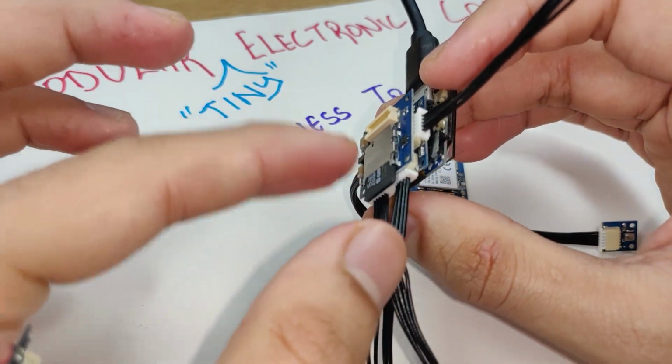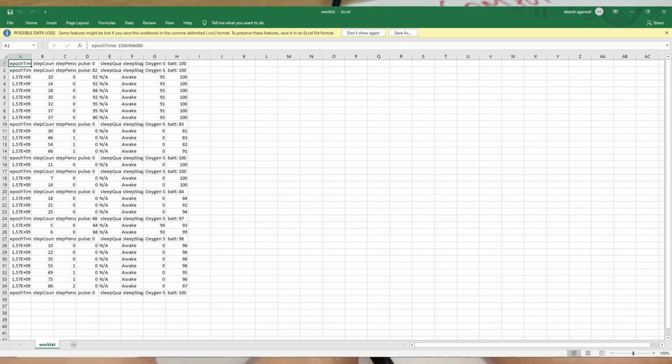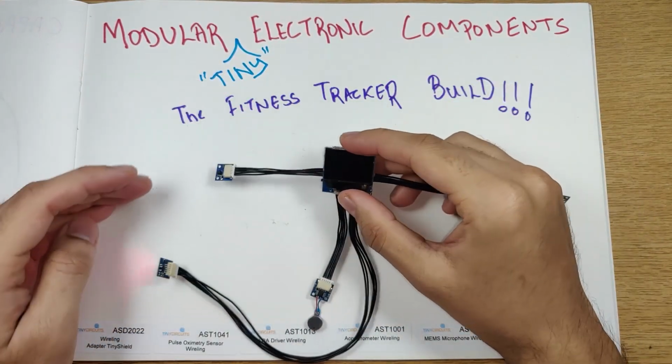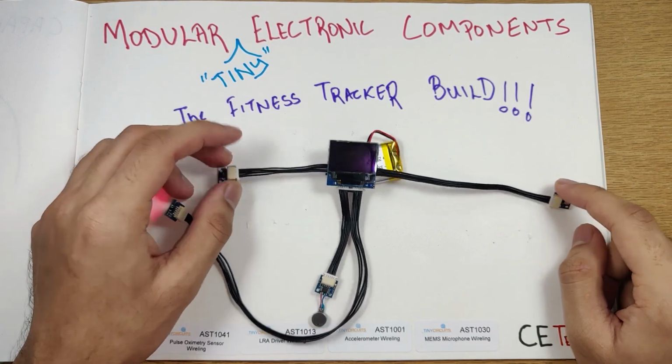So this SD card shield, when you connect it to your computer, you can see all the data that we see on the screen right now recorded in an Excel format. So that is the fitness tracker that we just built with the oximeter, the vibrator, the microphone, and the accelerometer.